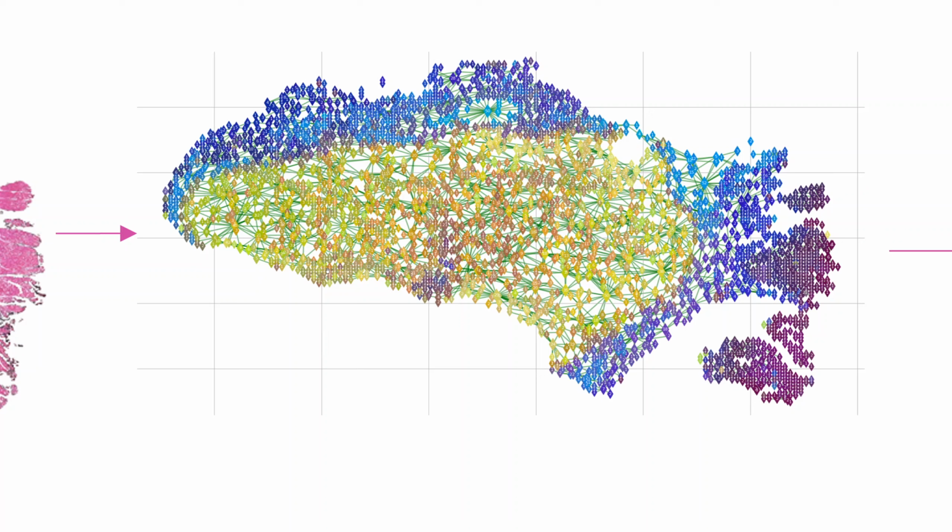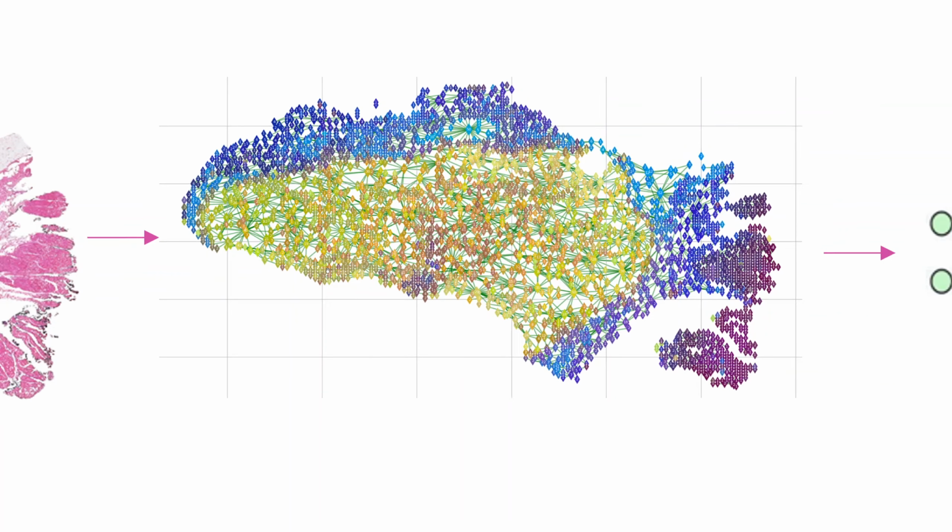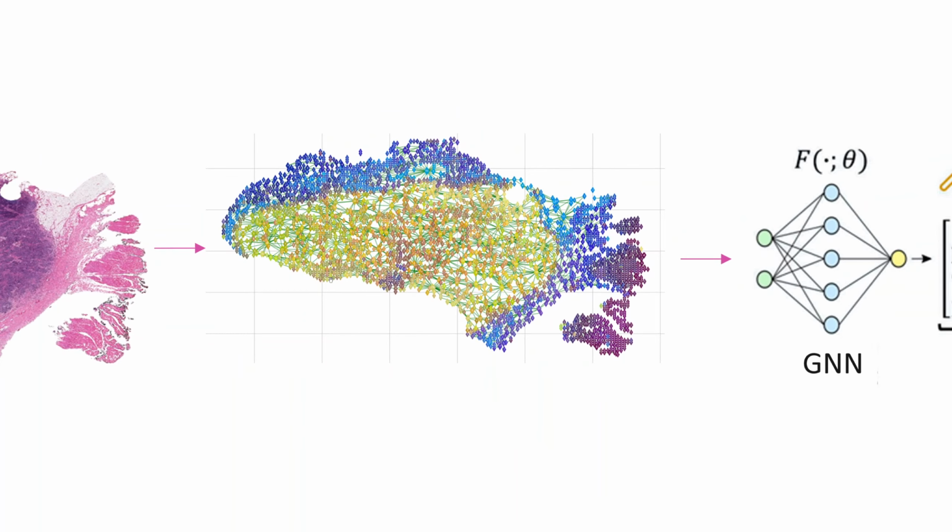Those features can come from deep learning models, or they can be very pathologist driven. For example, they can be glands in a colorectal cancer case, or colorectal tissue, and we can characterize, for example, the size of the gland, or how irregular it is, and so on. So each node in the graph is essentially a characterization of what is at that particular location, and then the edges between these nodes tell us, relative to other nodes, where that part occurs.